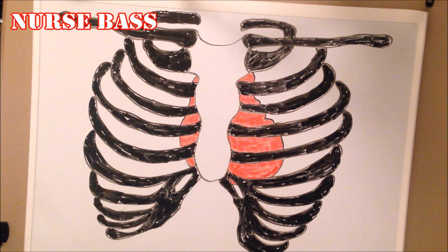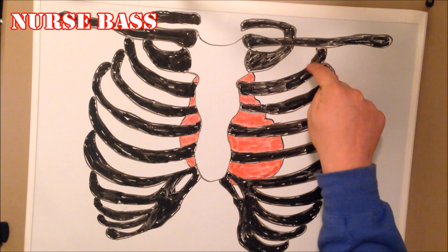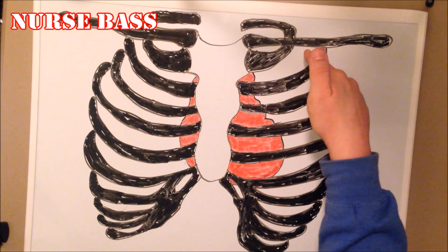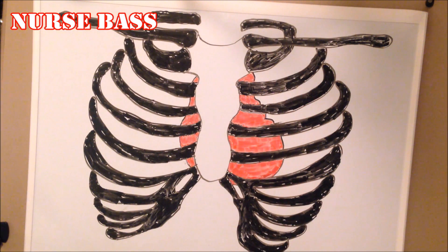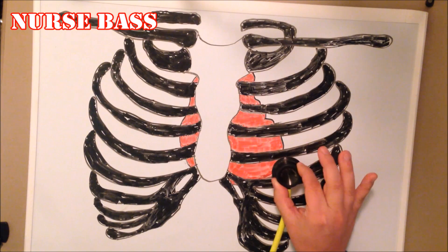The final point is the Mitral valve, which is also where you listen for the apical pulse because it is at the apex of the heart. You can think of it as the mid-clavicular line — the midpoint of the clavicle — at the fifth intercostal space: one, two, three, four, five. It should be right over the apex of the heart, and that is where you listen for your apical pulse for a full 60 seconds.